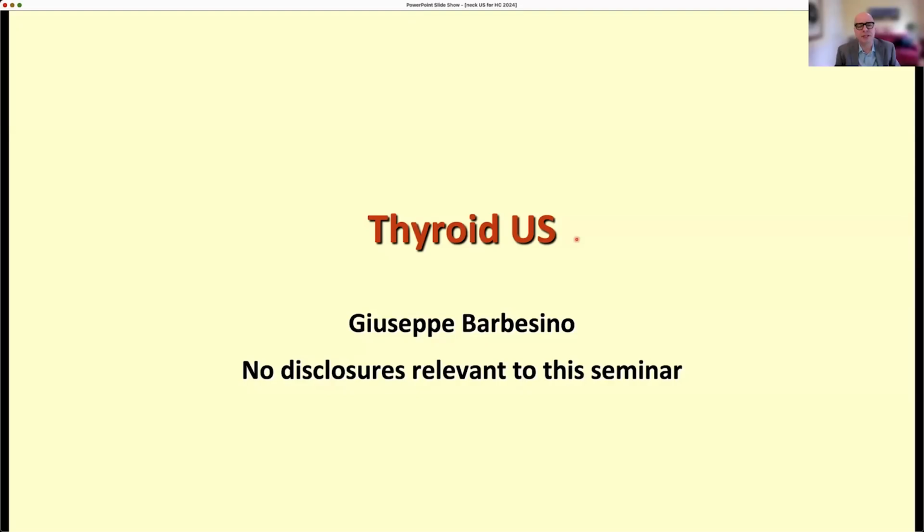So good afternoon. I'm Giuseppe Barbesino, one of the endocrinologists here at Mass General. I work in the thyroid unit, and I see mostly patients with thyroid disease. And today we're going to go over the way I see thyroid ultrasound.